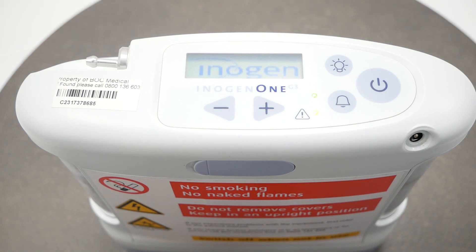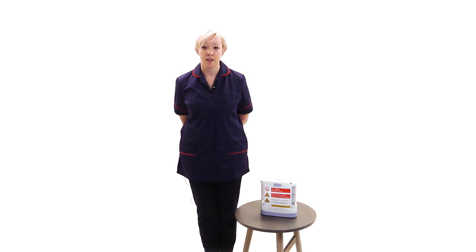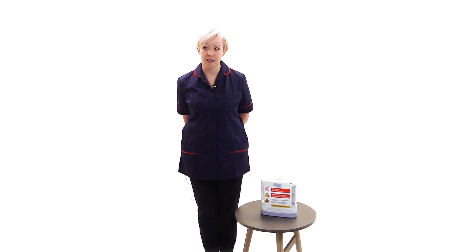Following this, the device takes up to 2 minutes to warm up. When powered up, the device retains the previous setting it was used at. If you need to change the settings, use the plus or minus buttons, but remember you should only do this if instructed by your healthcare professional. Position the nasal cannula on your face with the soft prongs sitting inside your nostrils and breathe through your nose. The device will deliver a pulse of oxygen when you inhale through your nose. A green light will flash on top of the unit each time a breath is detected. Make sure the nasal cannula is properly aligned on your face and you are breathing through your nose to trigger the device to deliver pulses of oxygen.